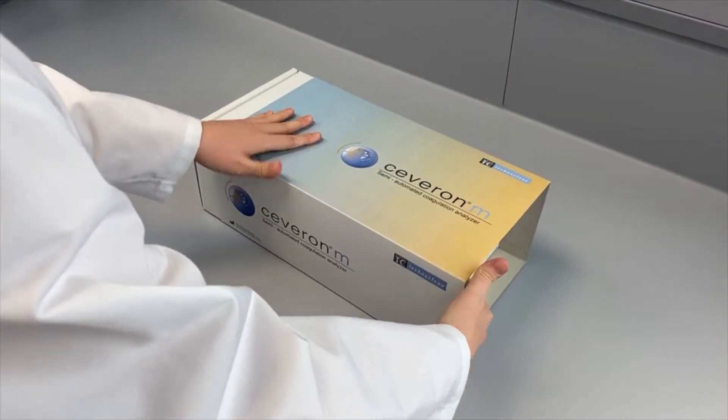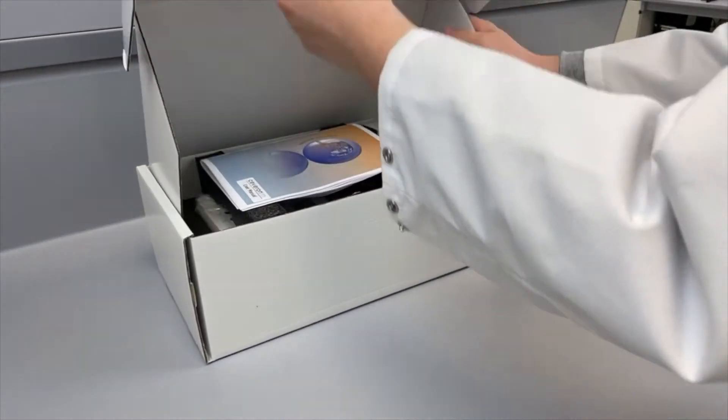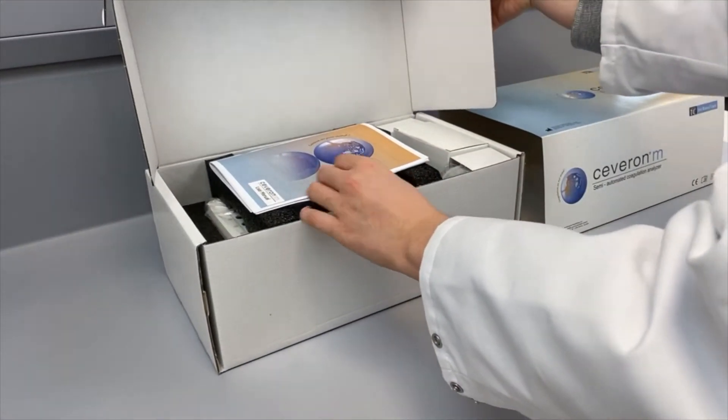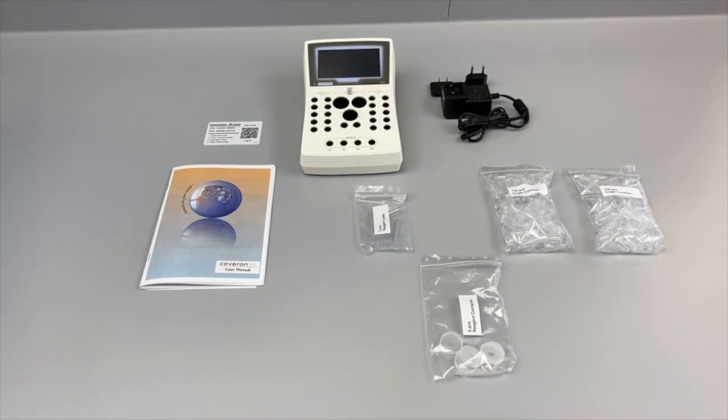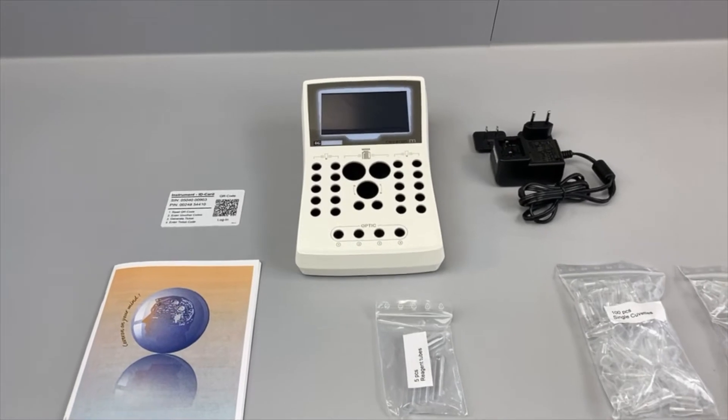Another major advantage is the capability of adapting the light intensity. Therefore, Severn M series instruments are able to minimize optical disturbances caused by lipemic, hemolytic, or icteric samples.